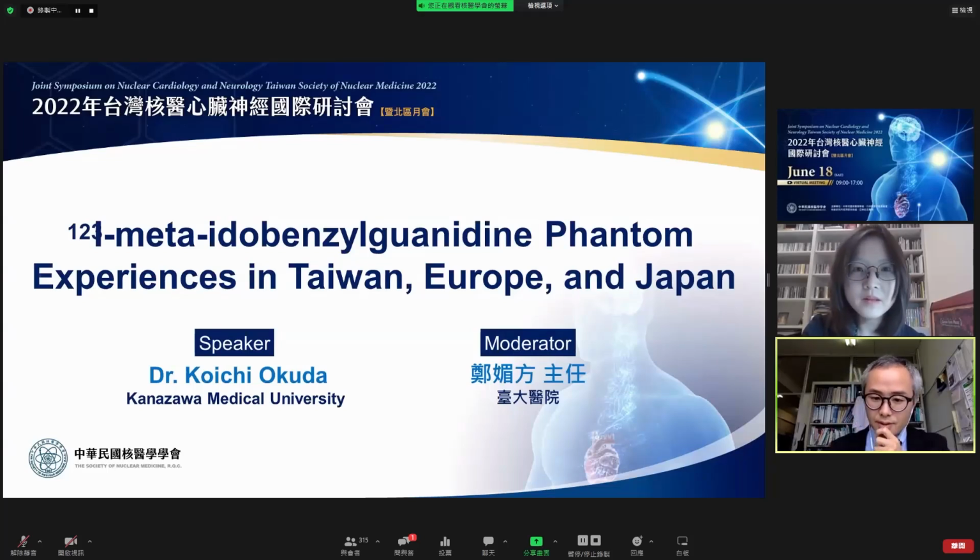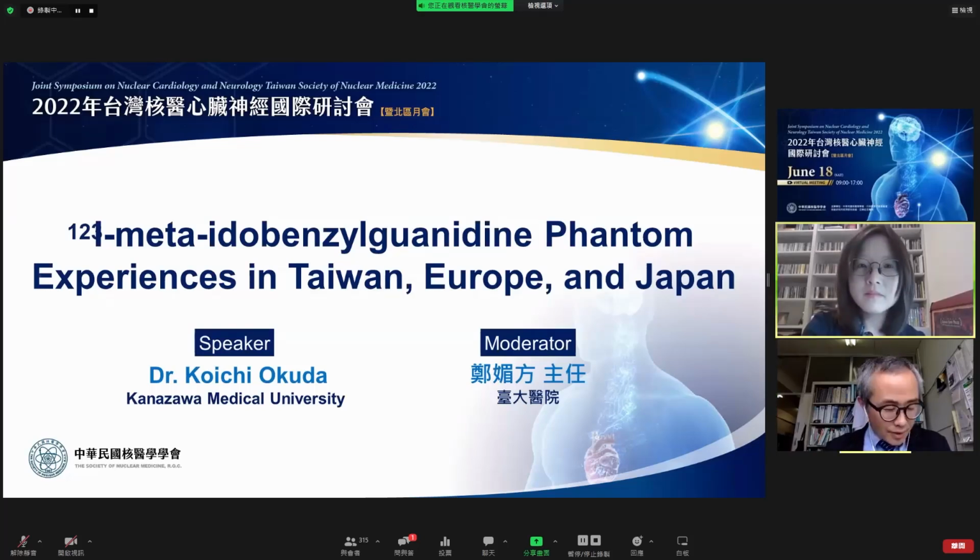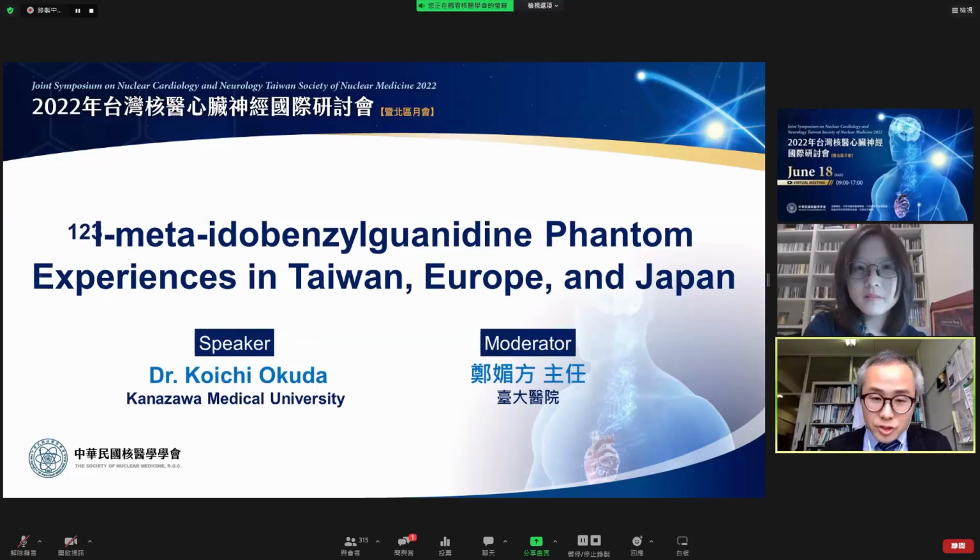The answer is yes. Dr. Nakajima and his colleagues performed MIBG quantification in SPECT and CZT cameras by using planar images, and HMR quantification has been performed.